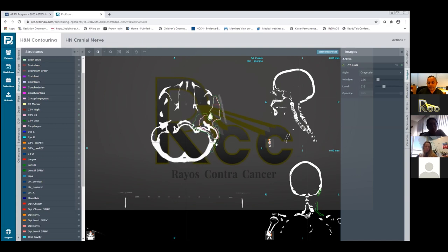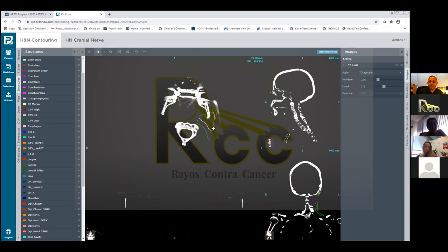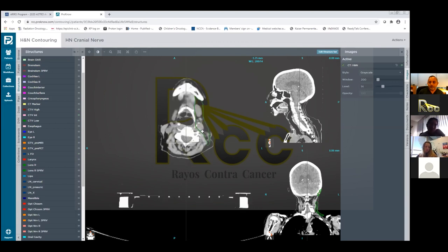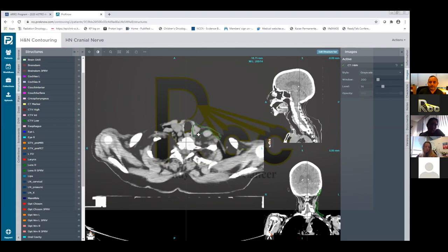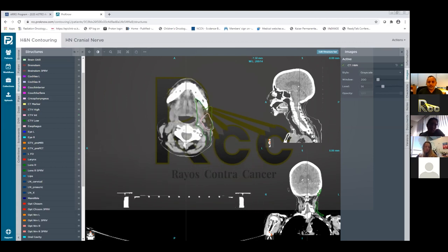So you can see, that's why you can see this little tail going down here. And then all of the neck in this patient, so this is the neck basically. Let me see if I can now, there we go. You can see I'm treating the ipsilateral neck basically to the low dose cloud in this patient. So all the way down, covering levels 2, 1B, 5, and then level 4 nodes. So covering everything.